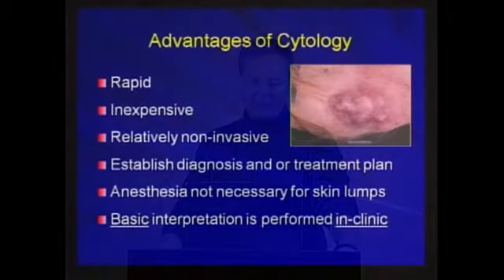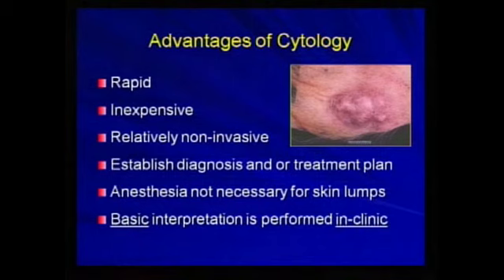We'll go to the first slide. Cytology certainly has a number of advantages. Now, I am trained as a histopathologist, and for many years, most of what I did was traditional histopathology. However, in the last decade, I've seen a tremendous rise in the number of cytologic submissions in addition to our traditional cases.